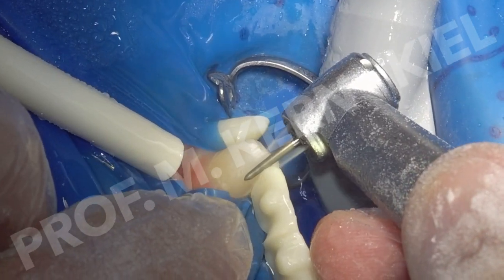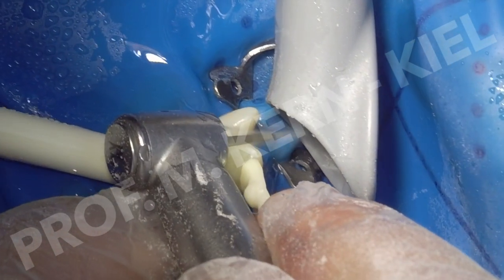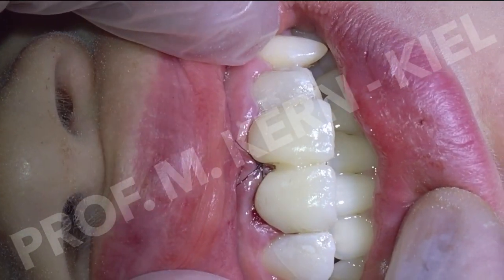Additionally, a veneer preparation was performed on the rotated left lateral incisor. After the removal of non-resorbed tooth remnants, provisional pontics were inserted.